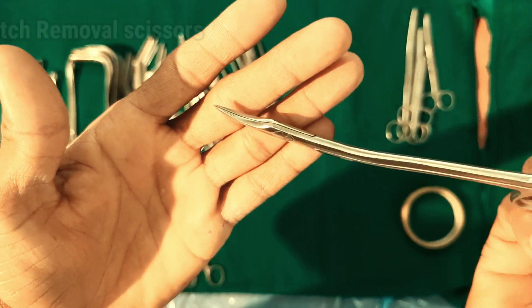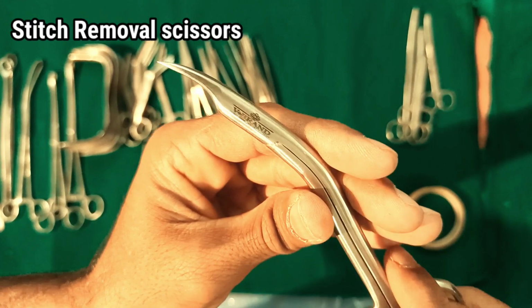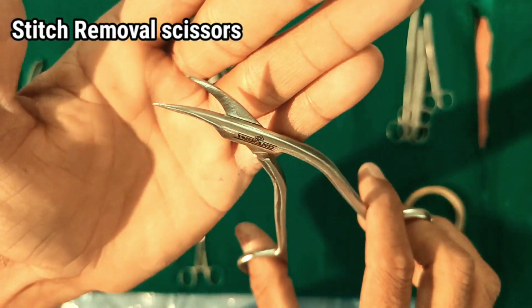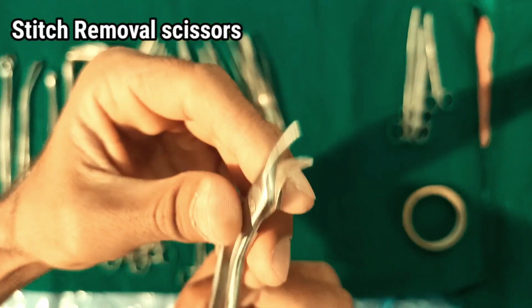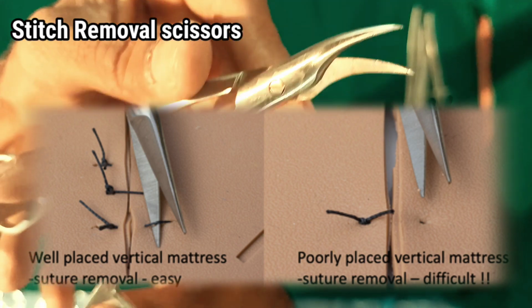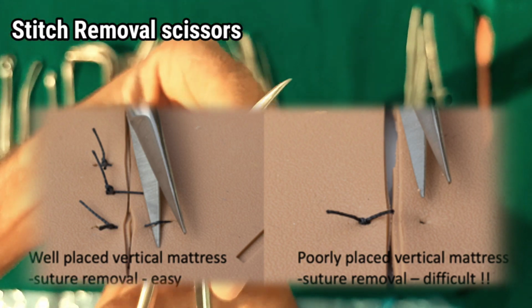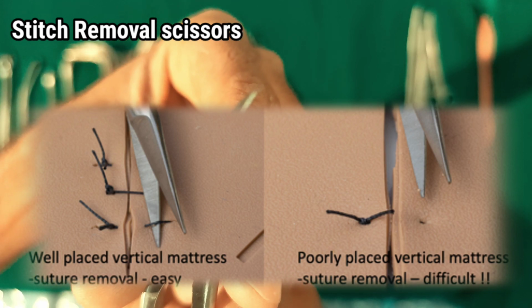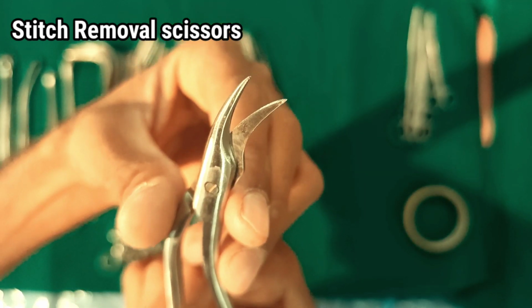Stitch removal scissors. Stitch removal scissors are primarily used for suture removal. These scissors have a small hook-shaped tip on one blade that slides under sutures to slightly lift them before cutting for removal. This hook also holds the suture so it does not slip off the blade of the scissors prior to cutting.